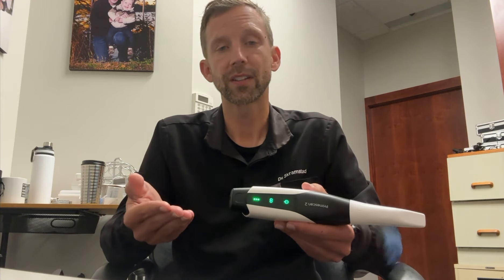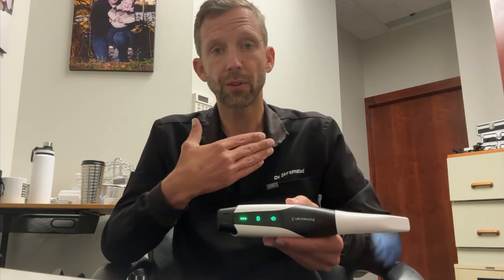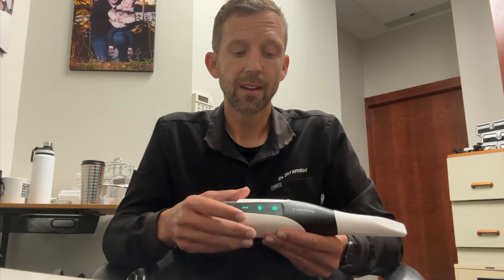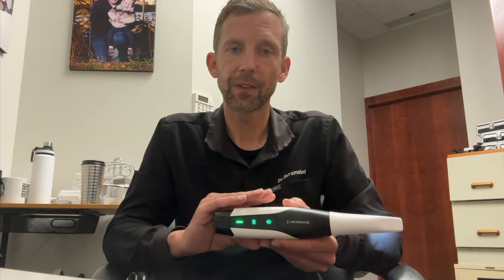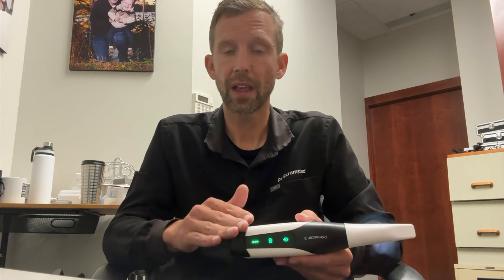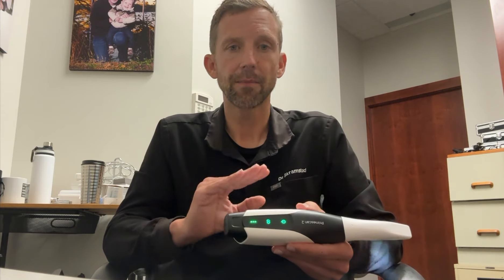Once it's there, you can do whatever you want. You can do the hybrid workflow and mill restorations, you can make a splint, you can 3D print things. This is really the only scanner that I'm now using in my office. We still have the PrimeScan and the PrimeScan Connect, and other dentists in my office are using those, but more and more people want this if I choose to give it up.